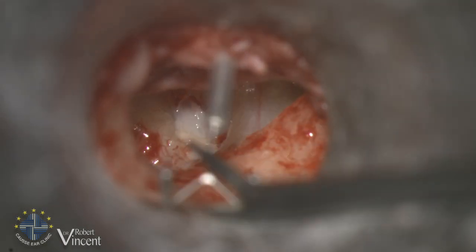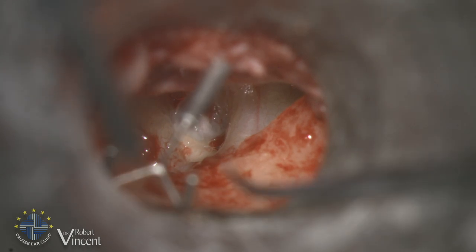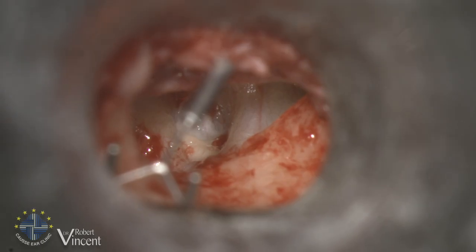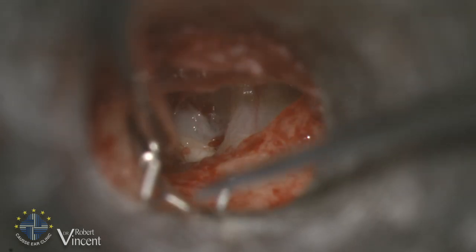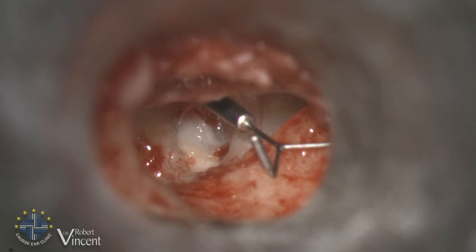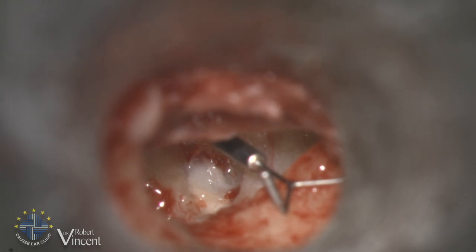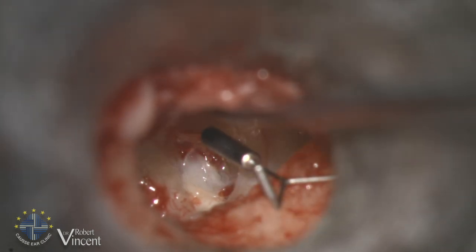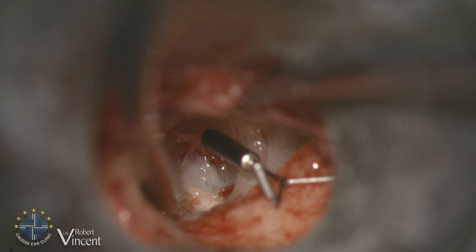This is typically the indication for the malleus prosthesis — I created it for this kind of situation where the stability of any type of reconstruction is very poor. As I mentioned, if you go to the literature, the success rate of ossiculoplasty depends on the status of the ossicular chain at the time of surgery. If the malleus is completely absent, the success rate is very low — no more than 30%, even lower, within 20 dB. By recreating the malleus handle, I think we increase the chance of success.